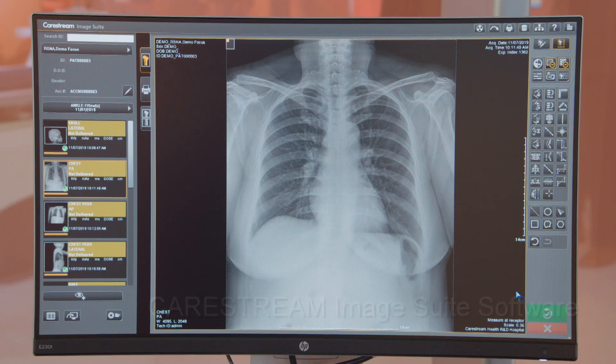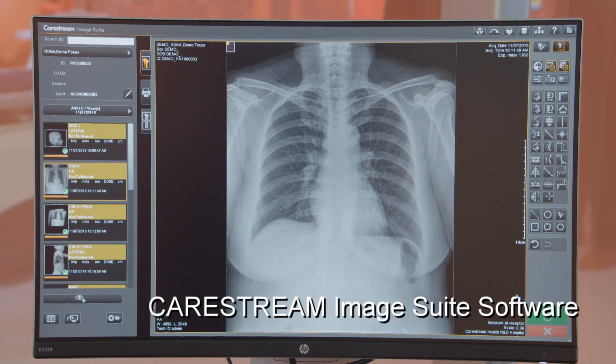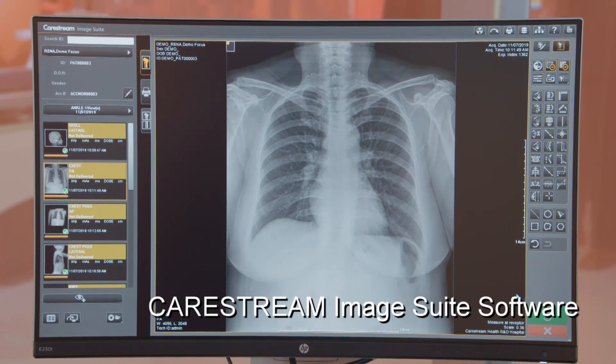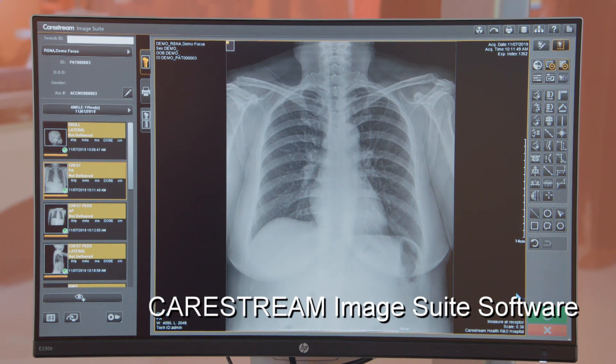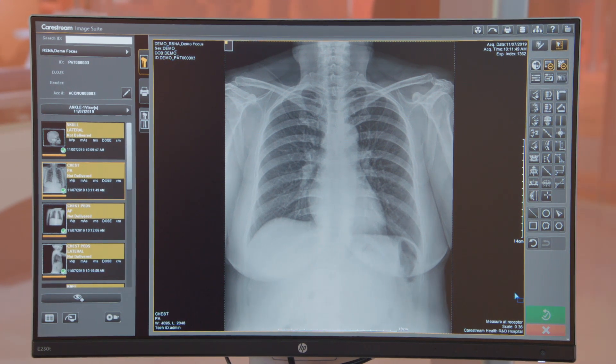Hello. Today I want to talk to you about the advanced measurement tools on the ImageSuite software. We're going to be looking at the cardiothoracic ratio tool, which is used to calculate the ratio of the maximum transverse diameter of the heart to the diameter of the thorax.